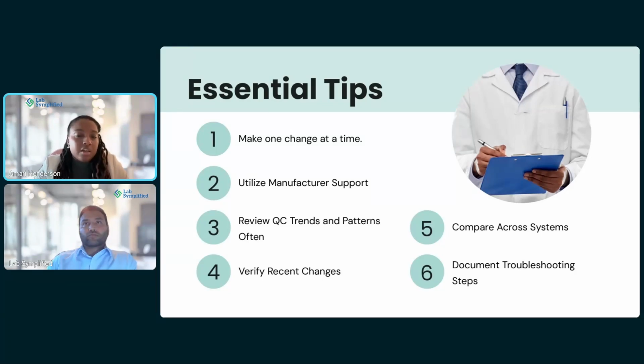So document every troubleshooting step you take, and the order, and that way it's easier for you to continue the process and figure out what the issue is.